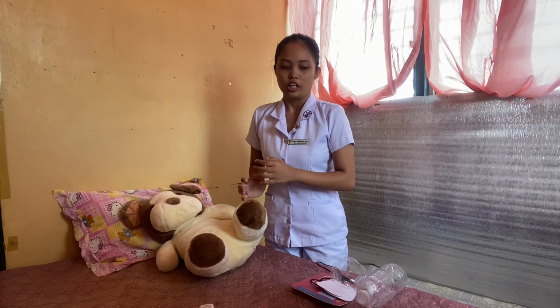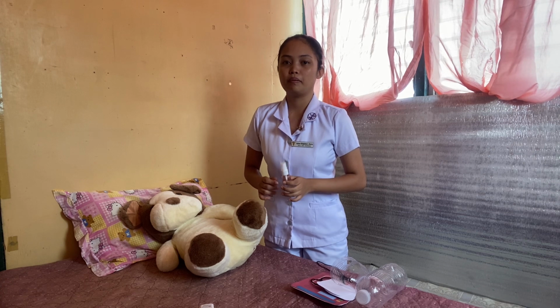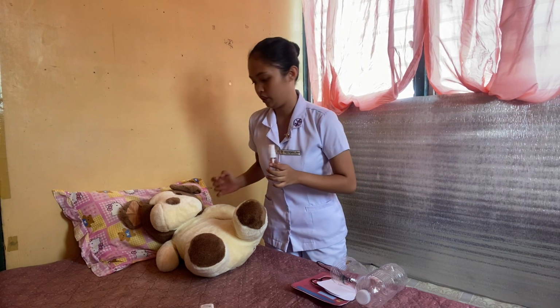What we have to do next is to open the baby's airway and suction if necessary. To suction the baby's mouth and nose, we use the suction bulb. We'll have to remove any secretion that's blocking the baby's airway, and after that we'll also do the head tilt, chin lift to open the baby's airway. If the baby is still not responding to the stimulus we did, we'll have to perform the PPV or positive pressure ventilation.